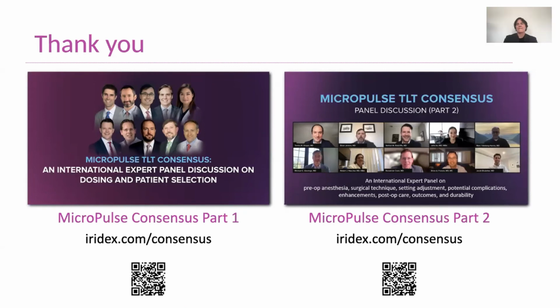Brian Francis? So I'll throw two observations in there. I think the first one is to come in without preconceptions. If you've done continuous wave in the past, if you've done a lot of ECP in the past, this is a different procedure. It's performed differently, and the safety profile is different. So think of it as a different procedure and don't come in with preconceived notions of how patients would respond, how much inflammation you're going to get, et cetera, based on those other iterations of cyclophotocoagulation.